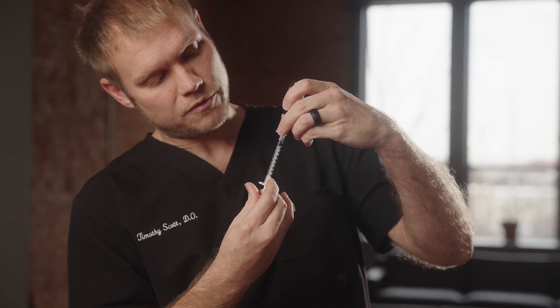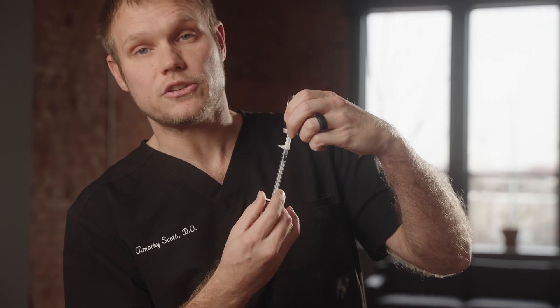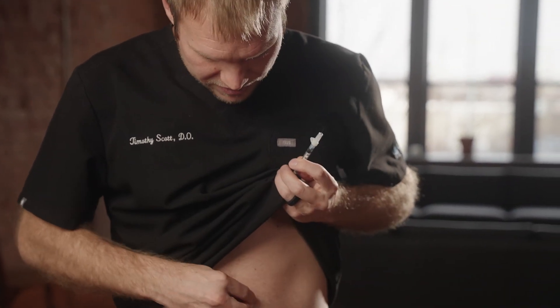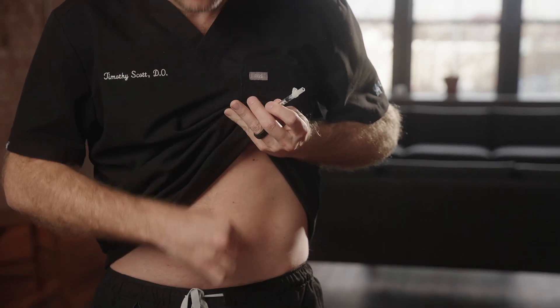For this particular video we said we were going to do 15 units, so my syringe says 15 units. Once I have that, I'm ready to inject. A little trick — you don't really feel these injections, but if you want to make it completely painless, take your alcohol swab and just scrub that site real good for a second before you inject.